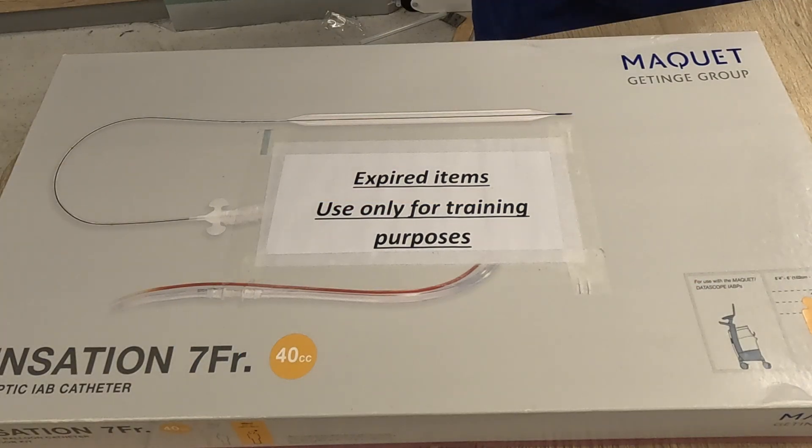There are some contraindications as well: severe aortic regurgitation and aortic dissection.